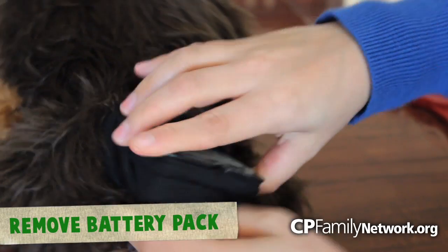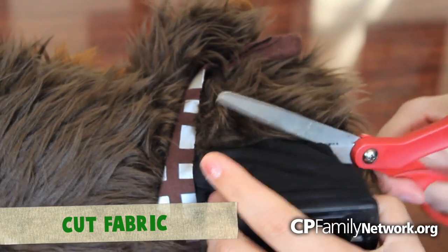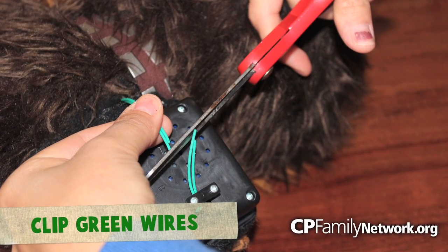The first thing you want to do is remove the battery pack compartment from the back of the toy. Next, cut along the sheath that holds the insides of the battery compartment. Here you will find two green wires. Cut these wires.